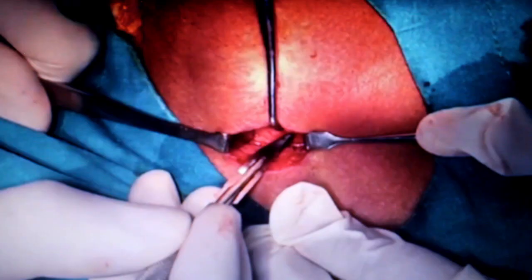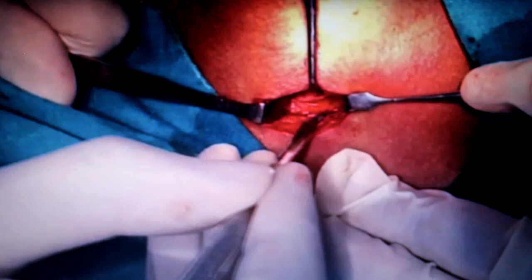And once you identify the trachea, inject 4% xylocaine into the tracheal lumen before putting the tracheal incision. This is how. And before spraying, withdraw the needle to see air bubbles. See the patient coughing in this. This patient is in local anesthesia. And you can put either a vertical incision or a horizontal incision over the trachea.